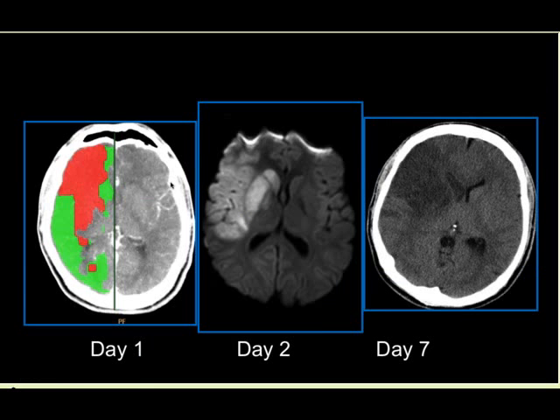The follow-up MR and CT showed the anterior frontal lobe progressed to infarct, but the more posterior portion of the MCA territory, which we suspected to be ischemic, did not. Clinically, the patient did great, returning to law school with little, if any, deficit.